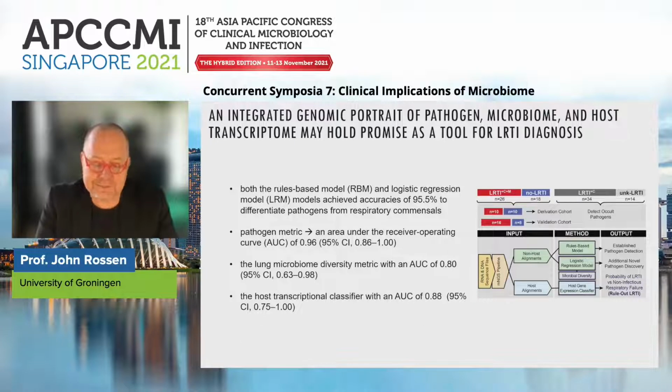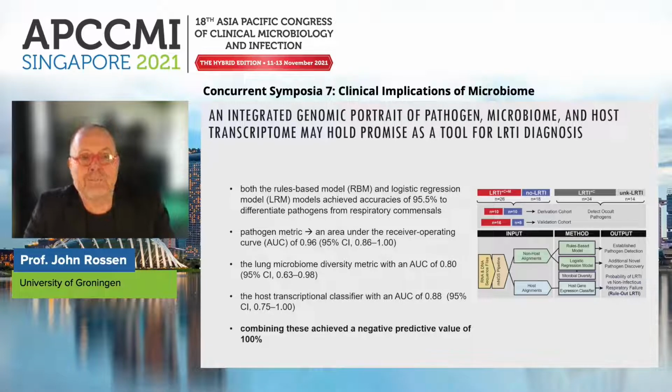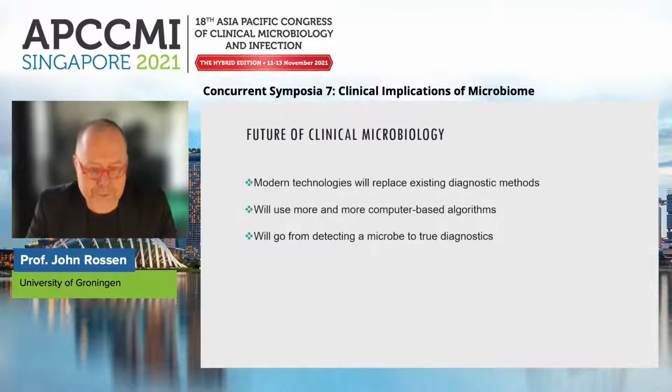However, interestingly, when they combined the outcome of these three metrics, they achieved a negative predictive value of 100%. And predicting in an accurate way, with 100% accuracy, a negative result is extremely important for treatment or non-treatment. So very promising results here.